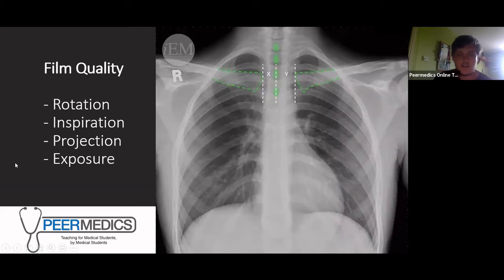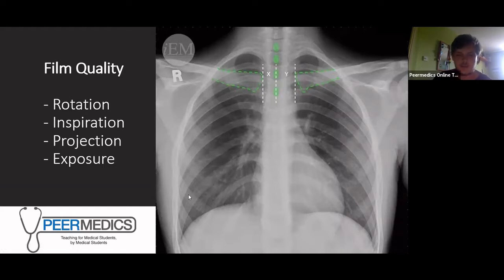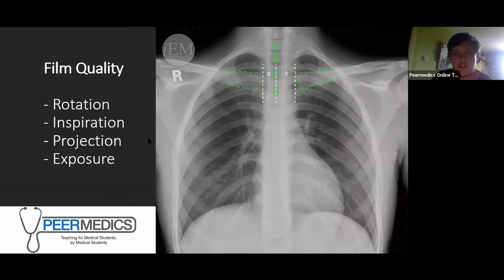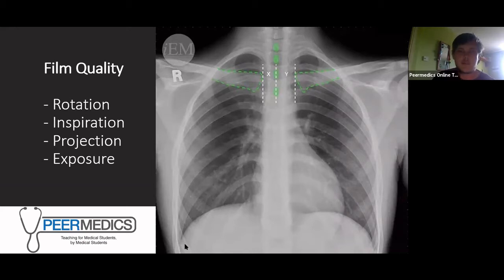For inspiration, most chest X-rays should be taken in the inspiration phase. You assess this by counting five to six anterior ribs. The anterior ribs are the ones that curve around. On this film you can see one, two, three, four, five, six anterior ribs, so this is a good quality film taken on inspiration.